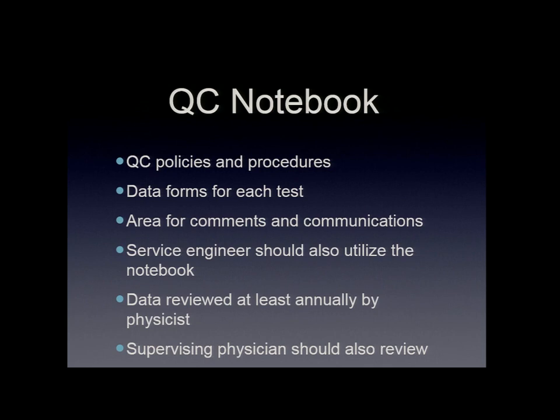It's recommended the service engineer also document when he or she does certain things to the scanner, so that you can see if there's a change in the QC. Oh, you know what? The service engineer was just in here, and that's why everything's different. You know, and maybe he forgot to recalibrate before he left, and that's actually more common than you would think.